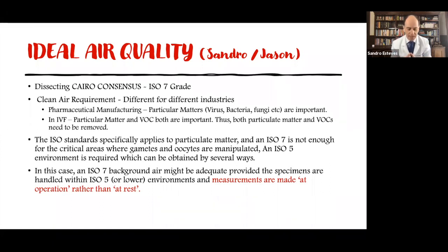But what is very important to consider is that we need to combine cleaning the air, not only of particles but also of VOCs. Another important thing is how people work in that lab, because the source of contamination is to some extent related to the operators. If the operators are not properly dressed, they will generate contamination. So we need to mitigate contamination by cleaning the air, but also by having good laboratory practices, including avoiding the generation of contamination. I think this is important.